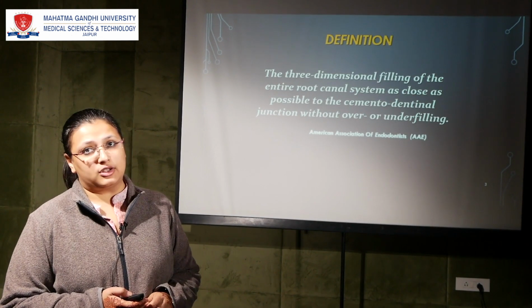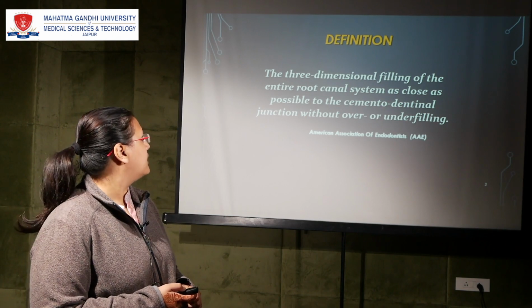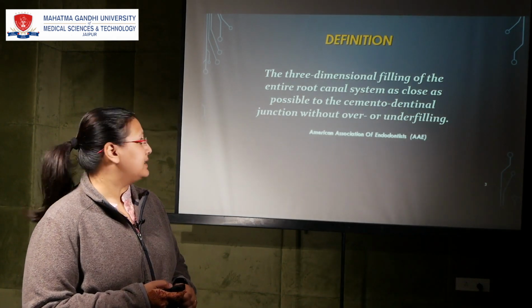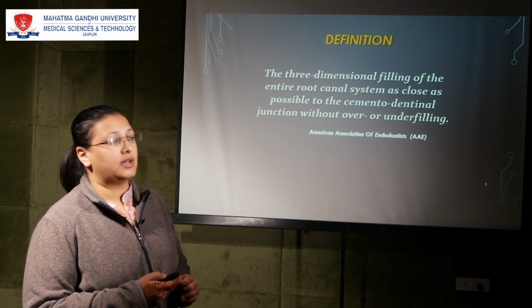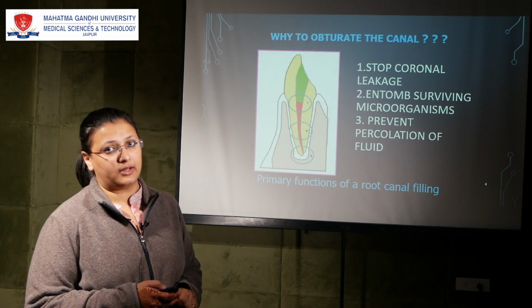So coming to the definition, the obturation is basically three-dimensional filling of the entire root canal system as close as possible to the cemento-dentinal junction, without overfilling or underfilling.